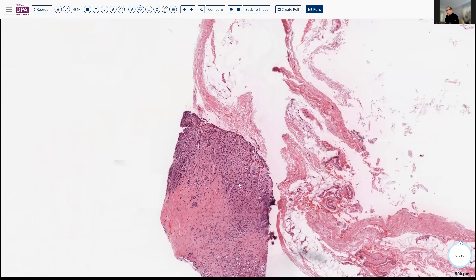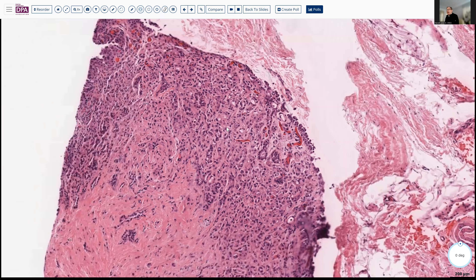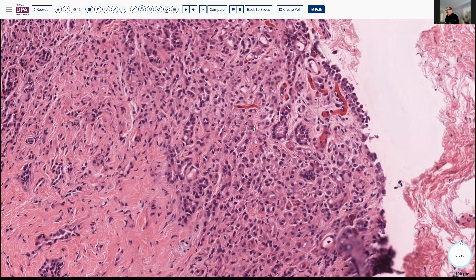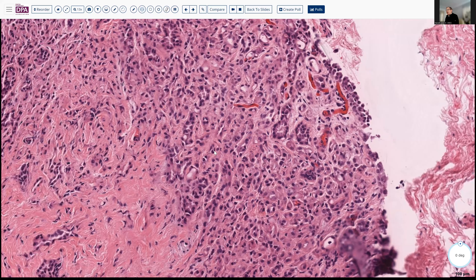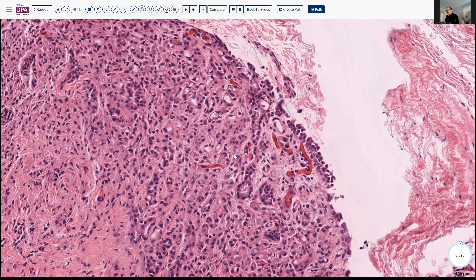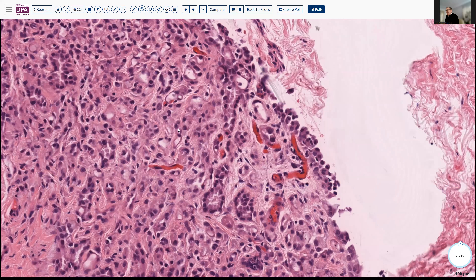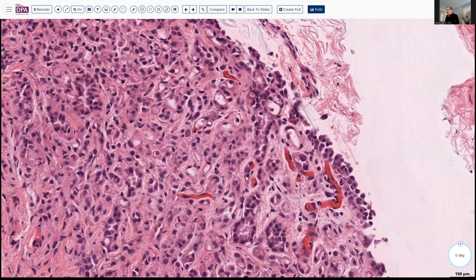The other feature of note was that over the several months of time that evolved with this patient, there was essentially no progression, no enlargement, and no extension of this process to other areas. The other clue — which we saw to a degree in the very first sample — is that it looks as though you have two populations: these corded cells with cystic spaces and microglandular spaces, and then surface mesothelial cells that look a little different — more reactive — while the others look more like neoplasia, forming tubules and microcystic spaces.